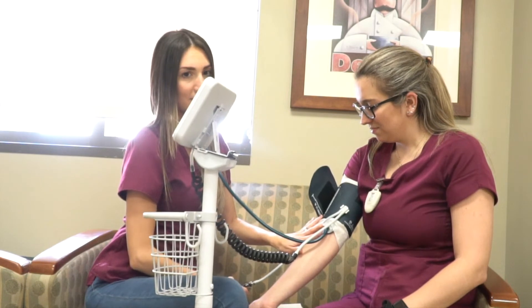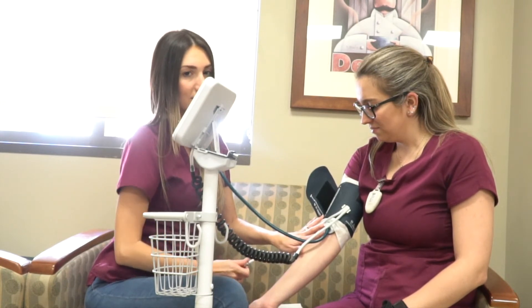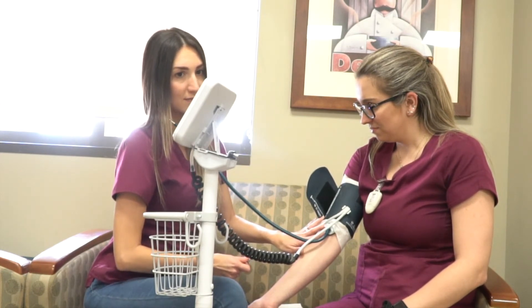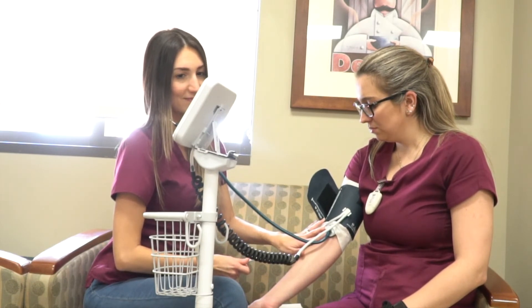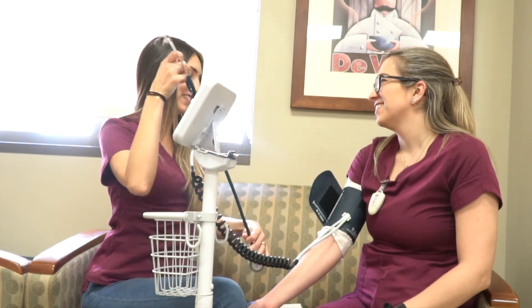Listen with the stethoscope and simultaneously observe the dial. The first little knocking sound is going to be the systolic pressure, the top number. When the knocking sound disappears, this is the diastolic pressure, the lower number. If the patient's blood pressure is super elevated above 150 over 100, it definitely requires some attention or some medication. If the blood pressure is extremely low or extremely high, or the patient was moving too much, be sure to take it again on the opposite side just to confirm your results.